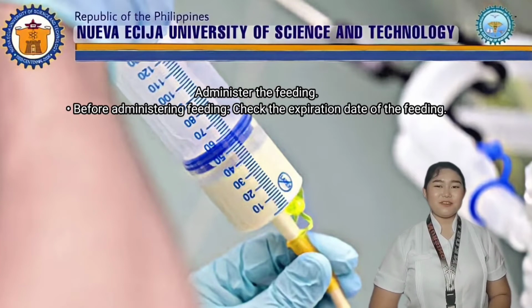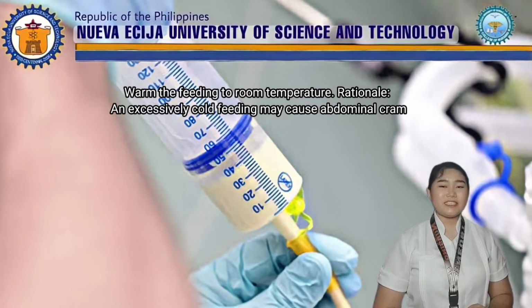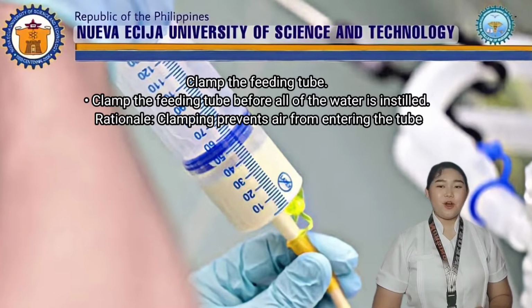Administer the feeding. Before administering feeding, check the expiration date of the feeding. Warm the feeding to room temperature. Rationale, an excessively cold feeding may cause abdominal cramps. Clamp the feeding tube. Clamp the feeding tube before all of the water is instilled. Rationale, clamping prevents air from entering the tube.